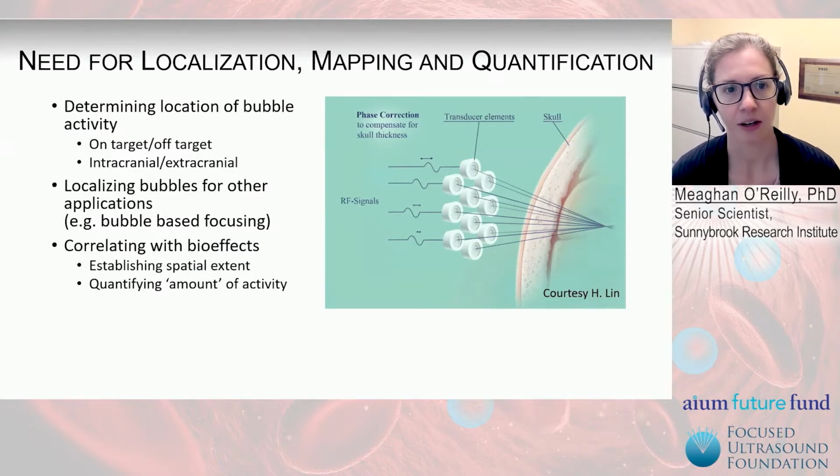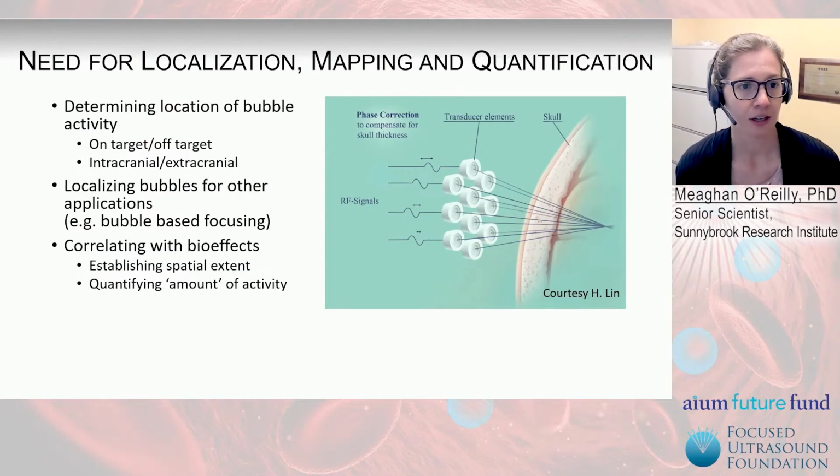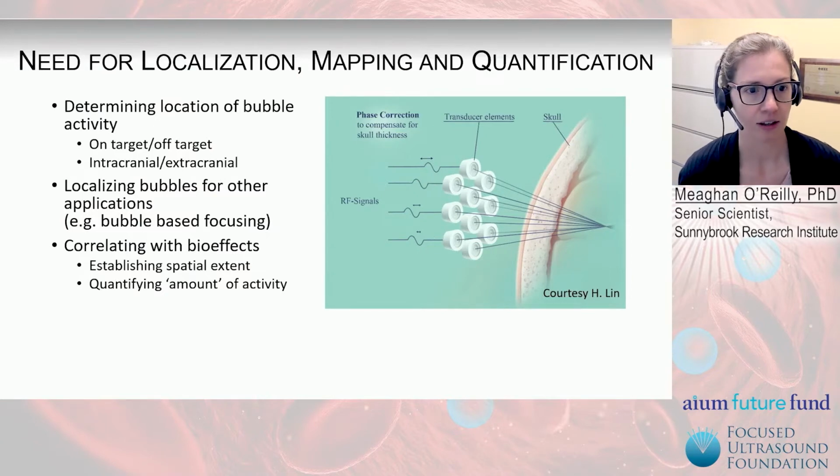We need to determine the location of bubble activity to assess if we're on target versus off target. In the case of the skull or the spine, we need to know if we're inside the bone or outside the bone. We may also want to localize bubbles for other applications, for example, for bubble-based focusing, and I'll talk about that later in the talk.